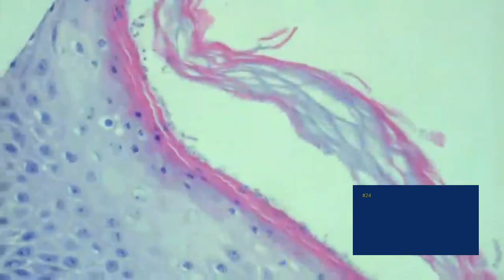I think the kid had no disease, so it was not really a question of diagnosis. There are lots of organisms involved. It could be dermatophyte, it could also be candida possibly, but it could be secondary. But there's no question that there's a lot of fungus. But let's say that they didn't have it. This could still be caused by the fungus, because fungus can do a lot of stuff. It's a good case, and I don't know this case personally, but presumably the fungus is just secondary. I don't remember the case. It's been quite a while since it was diagnosed. But there's definitely some organisms here.